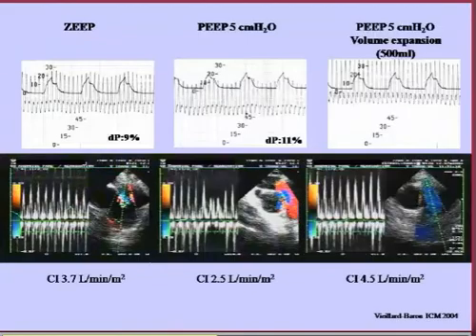So we infused fluid, of course, 500 milliliters. You can see now the pulse pressure variation, no pulse pressure variations. And look at now the right ventricular ejection flow and the respiratory variation of the superior vena cava. You can observe the disappearance of the collapse, and the left ventricular stroke index was significantly increased. So this is a good demonstration of how to check the efficacy by keeping the probe in the esophagus.